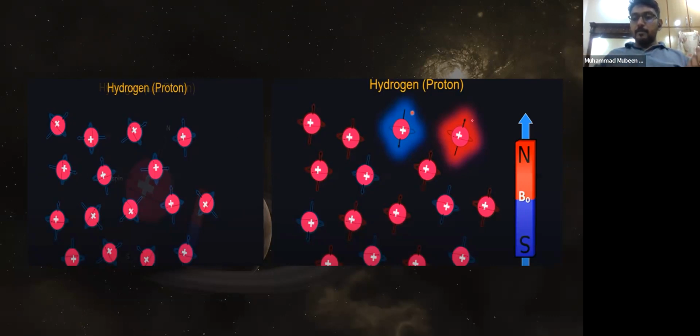But when we place the body in a very strong magnetic field, most of these hydrogen atoms align parallel to the magnet that we place the body in. Very few align opposite; they tend to remain on the lower side of the energy. The great abundance of these atoms align themselves along the magnet.